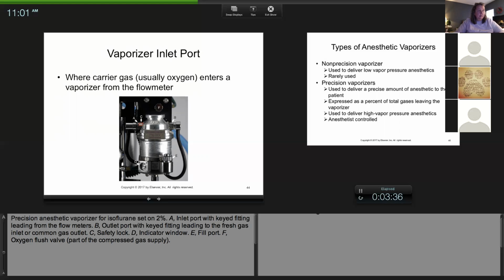But if this is left on, and that's been a mistake people have made. Sometimes people disconnect the patient and forget to turn things off. And then someone goes to grab that machine and hooks up oxygen. It would run anesthetic gas. So when you're done, you always want to make sure that this is in the off position. Because a lot of clinics will use their anesthesia machine to deliver oxygen in an emergency setting.